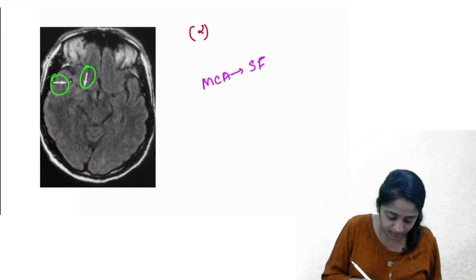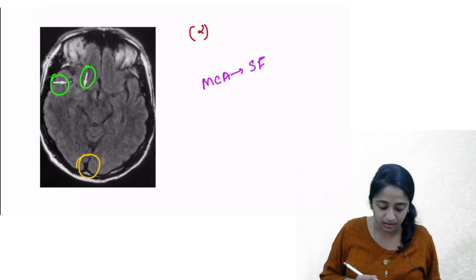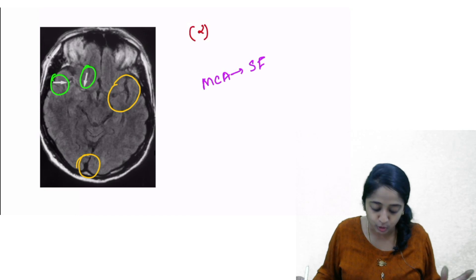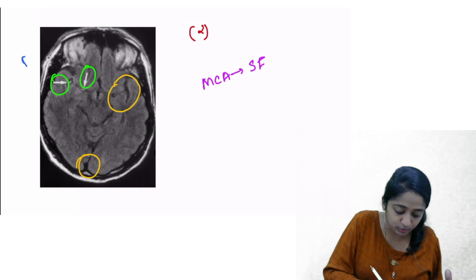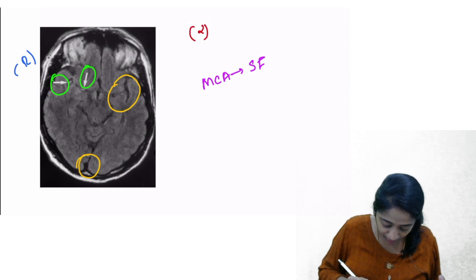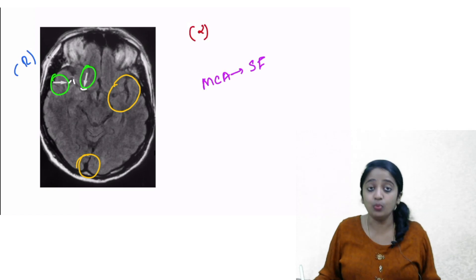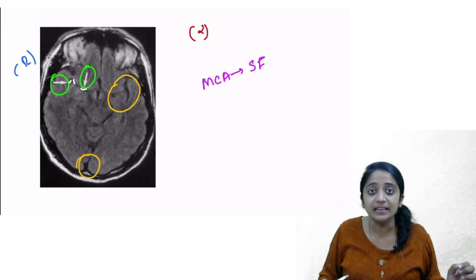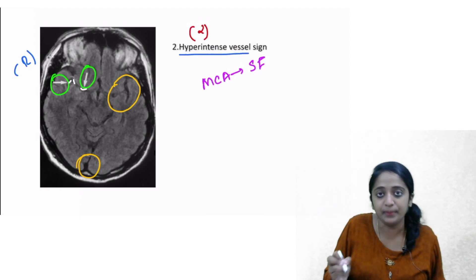For example, look at the superior sagittal sinus — it is black. Then look at the contralateral sylvian fissure — you don't see any hyperintense structures. But on the affected side, you can spot a hyperintense vessel within the sylvian fissure. This is known as the hyperintense vessel sign.